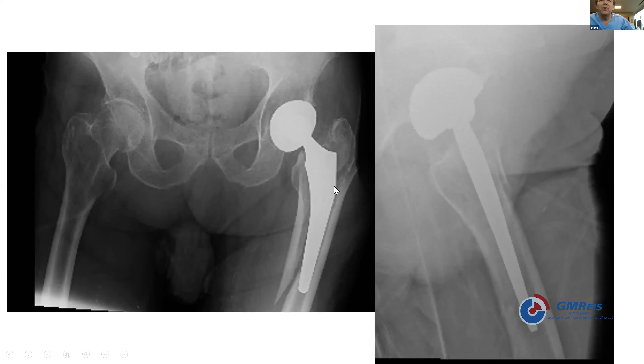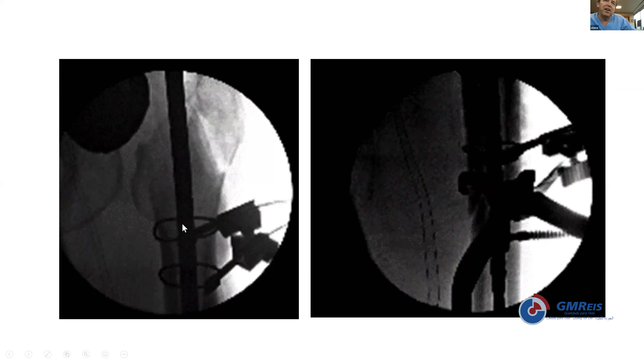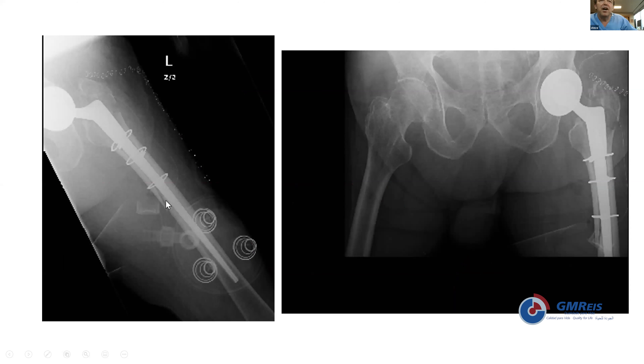Another case illustrates that these wedge-shaped prostheses, if they don't get bony ingrowth over time, act like a wood-splitting device — and if a patient falls or stumbles, the whole femur can split. The technique here uses cerclage cables to reconstitute the intramedullary canal, then uses the revision device like a nail for the fracture with stability distally, with judiciously placed cerclage cables and early weight bearing.